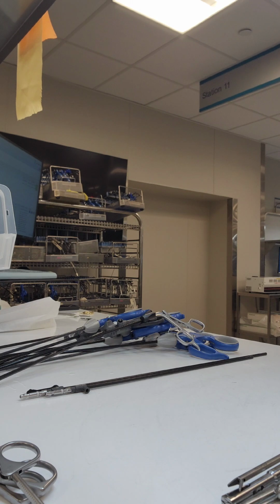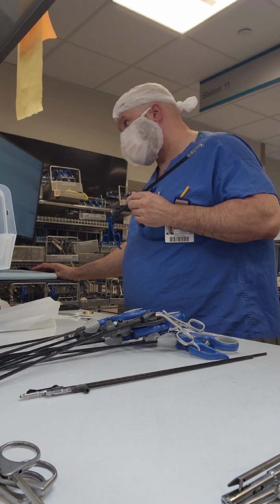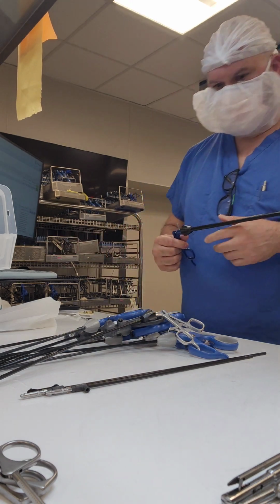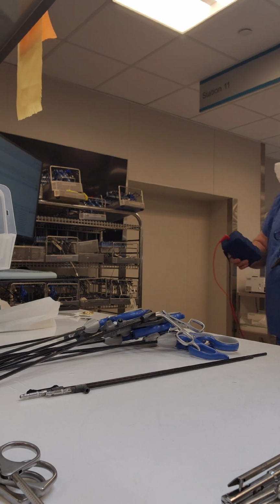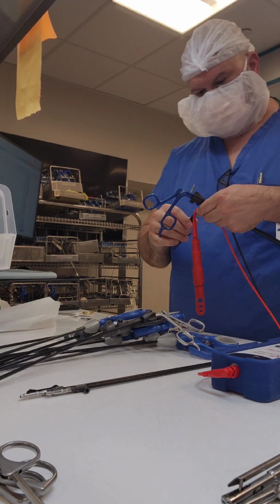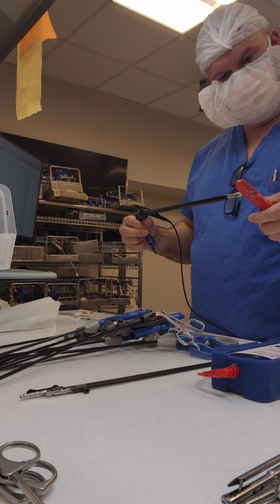So maybe this set doesn't require all these instruments, but it still has a missing instrument. They wanted that instrument in that set for a reason. It's no longer a quality instrument set. Is it a usable set? It may be, but it's no longer quality. That's a bargain. If I'm picking a case, I'm going to overlook that tray, regardless of whether it was first in, first out. I'm looking at that set and I go, oh, this set is missing an instrument. I need to put the set in there that's complete, not the one that's missing.